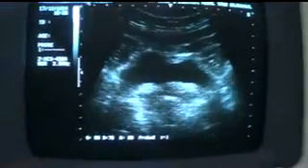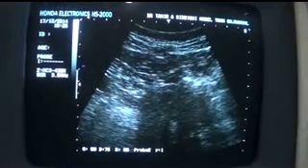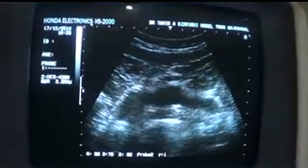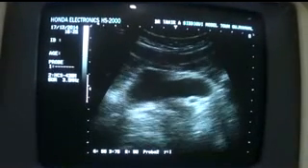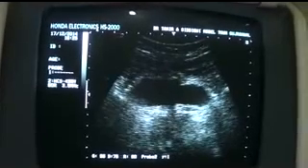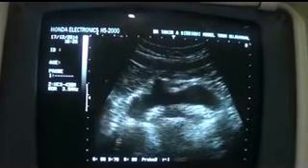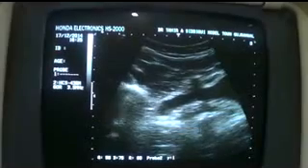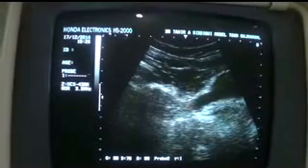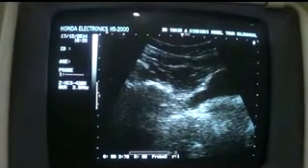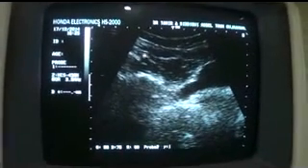The same technique we will use on the left side. Now let's see it on the ultrasound. This is the suprapubic region — here I am angling the probe towards the patient's feet to get the transverse section of the urinary bladder. Now I am going to move the probe towards the right side. My intention is to get the right ovary first, and inferiorly I will angle the probe towards the right side. Now you see these are the iliac vessels.